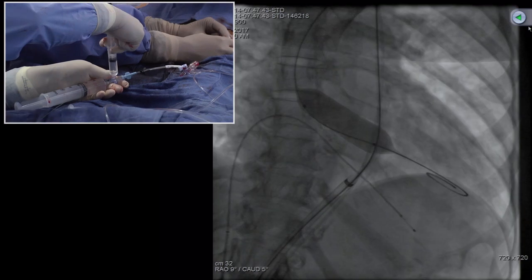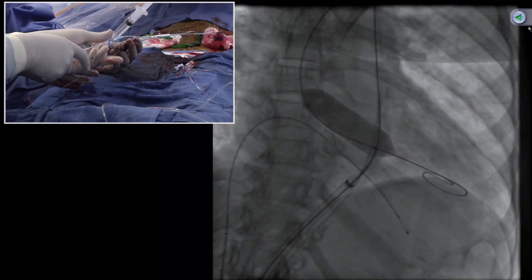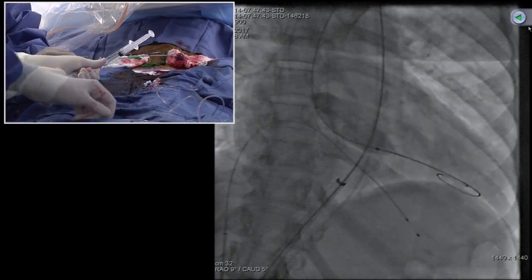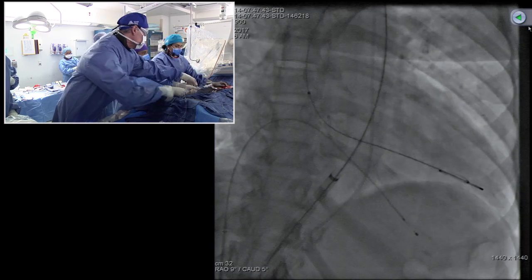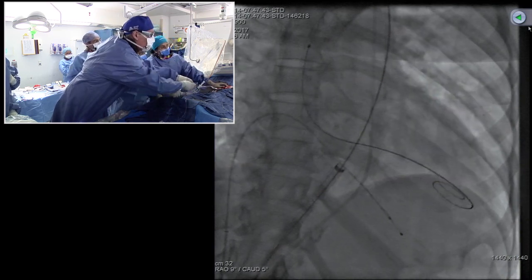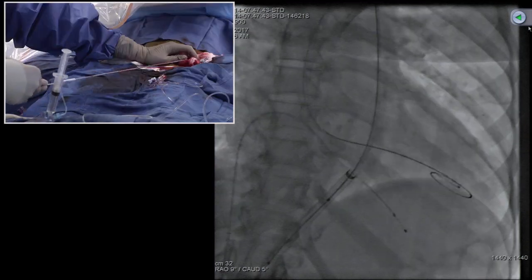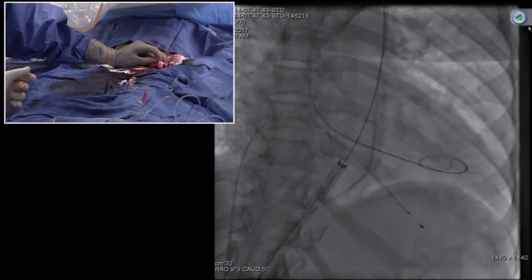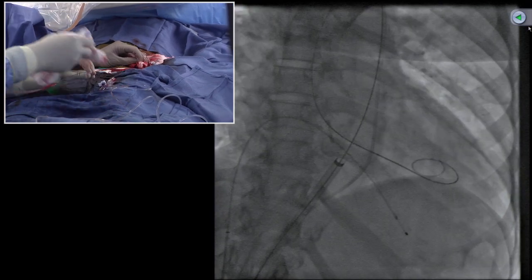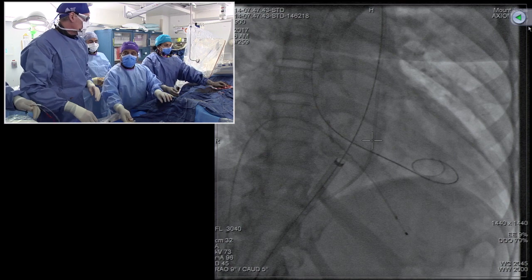Good. So the second syringe going in, nice expansion of the balloon. Okay, once the balloon has deflated, we are holding the sheath. Okay, good, no suture. Yeah, hold the sheath in place and watch your wire, so you don't lose the place. The difficult part of this is in any exchange that you do, there's always a chance a wire may dislodge. And the operator has to actively surveil that possibility and keep the Confida stable.